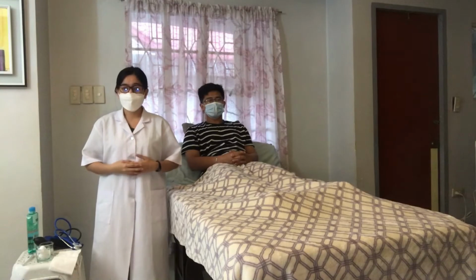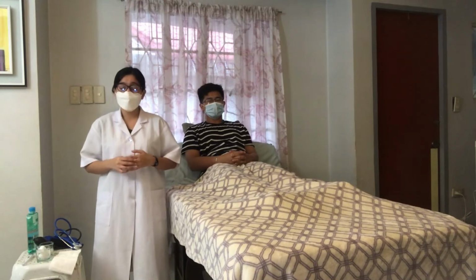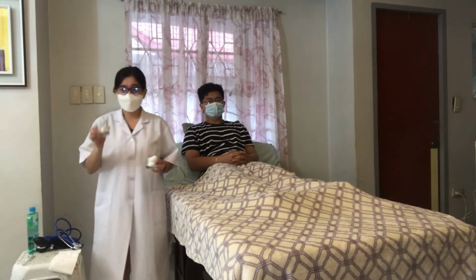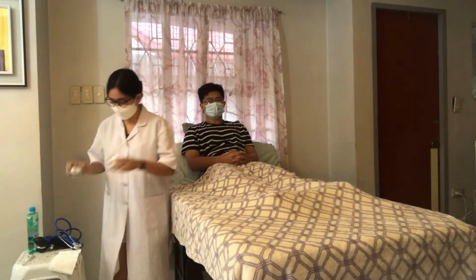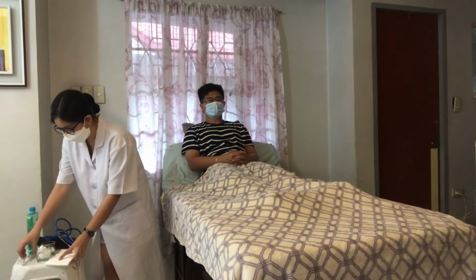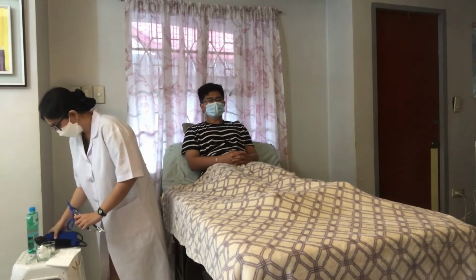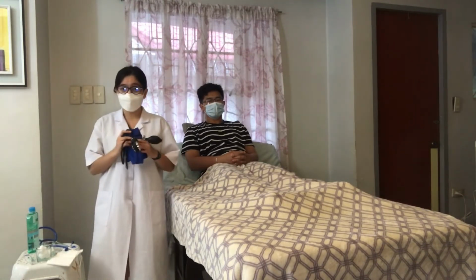So now I will be demonstrating the proper procedures of taking vital signs. In taking vital signs, we must first prepare all the materials and equipment needed for the procedure. So I have here my alcohol and my 2 cotton balls, in which these ones are wet or already applied with alcohol, while these ones are dry. Then I also have my paper towel, my thermometer, and then my stethoscope, and my sphygmomanometer.